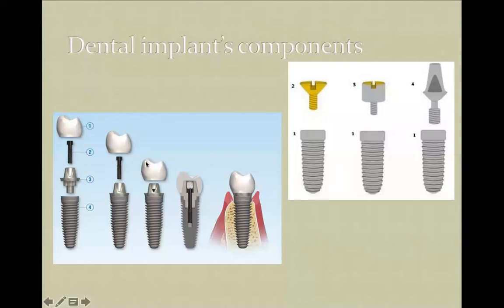When we're looking at the dental implant as a prosthodontic device, we have to talk about the abutment. That is a kind of transmission part in between the dental implant and the artificial crown. And this abutment usually will be fixed by an internal screw. It is very important to understand that within the dental implant, we have external threads and internal threads for the internal screw.